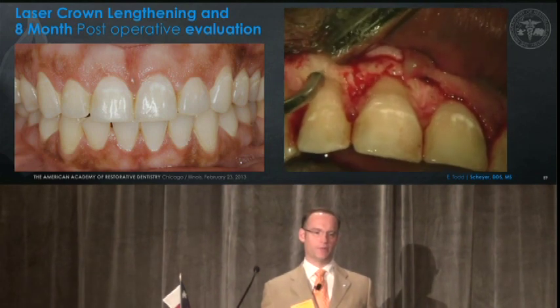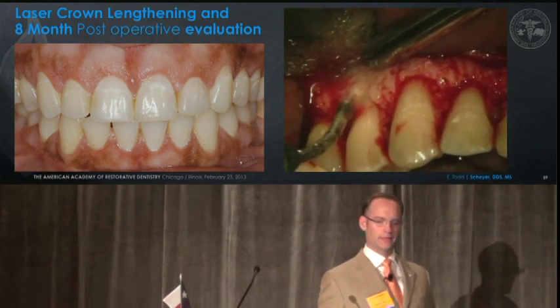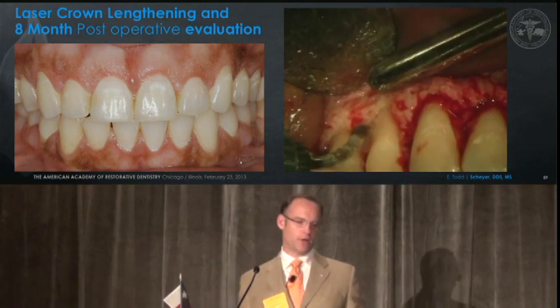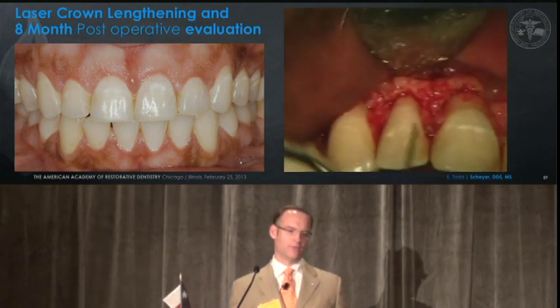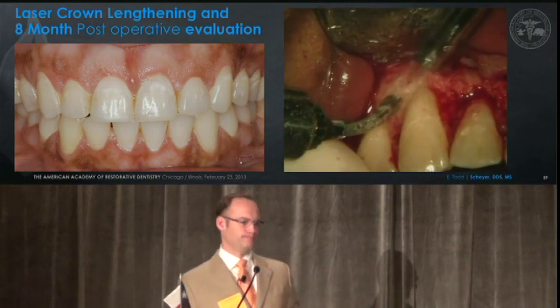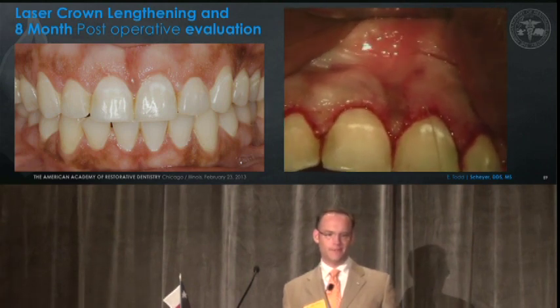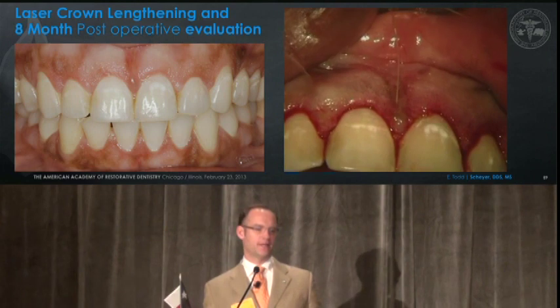We're just coming back and modifying the bone as appropriate. If you look very closely, you'll see some vertical root grooves that I created, especially on this first bicuspid. Indeed, patience is a virtue when using the laser for hard tissue removal. We're making sure we have an osseous crest level that's favorable, going back and forth between measurements and sounding, repositioning our mucoperiosteal flap, and using a 5-0 plain gut suture.